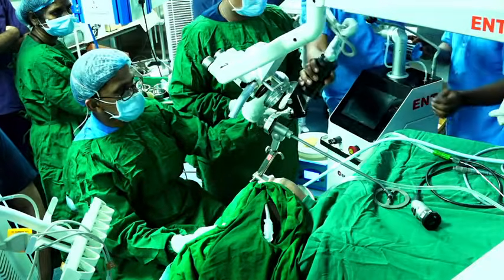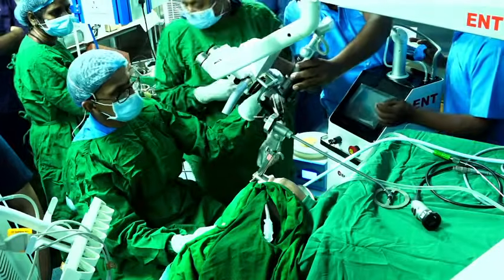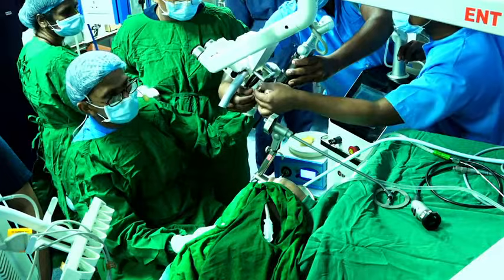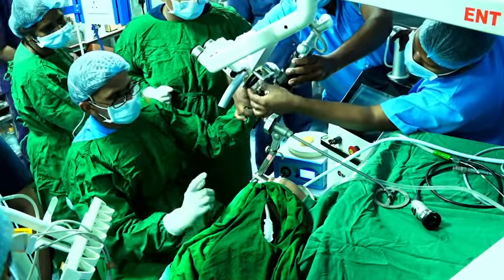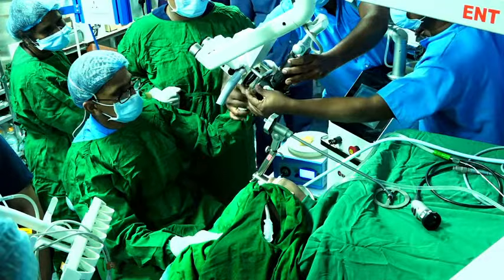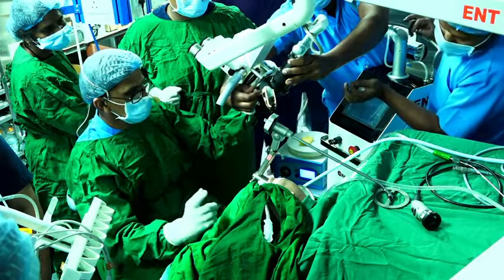Microscope switch on. Connect. So they are making connections, they are connecting it.